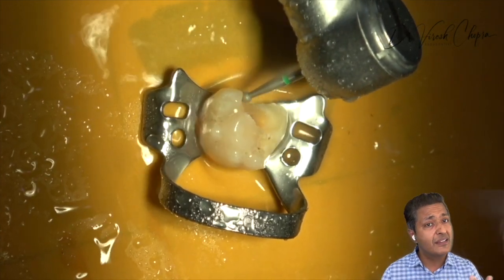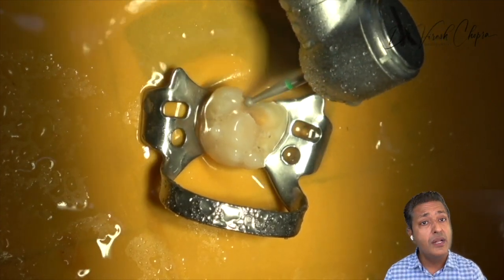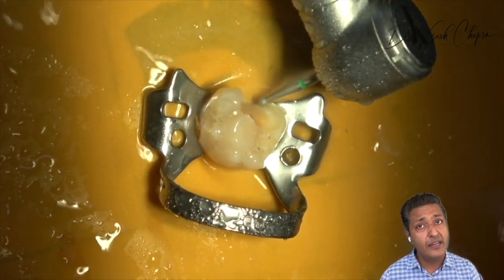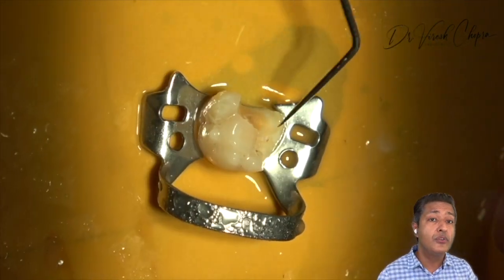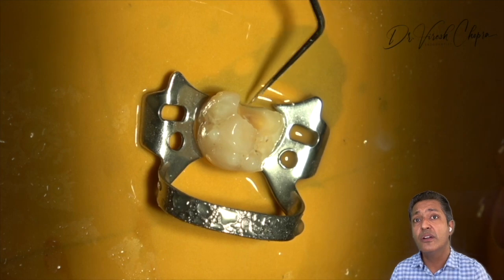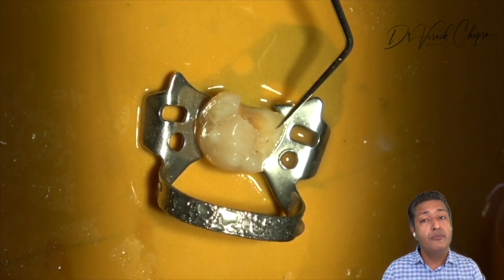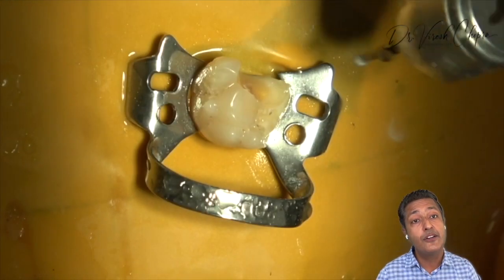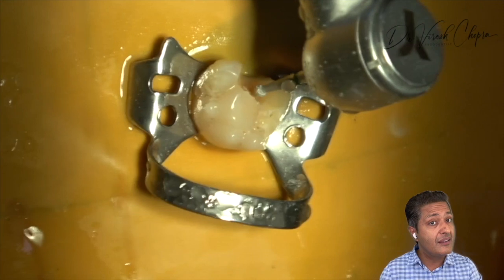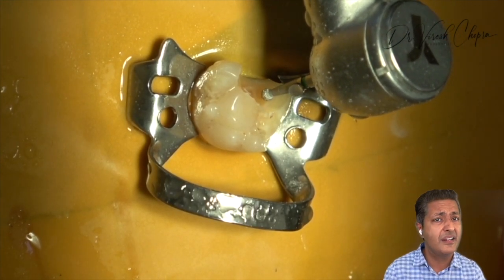Once we have excavated the carious lesion with this brushing action and we know that it has been clearly done and there is no peripheral caries, this is the time when we need to use our DG16 Explorer or the Endodontic Explorer and check our periphery. Once we confirm that the periphery is sound, this is the time to move towards the central caries, and with the same brushing action just excavate the central carious lesion.